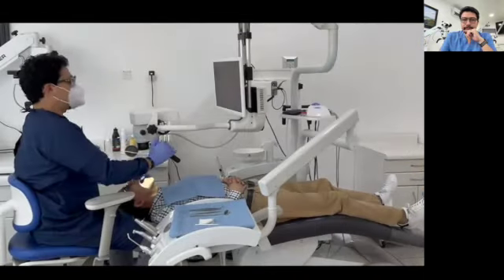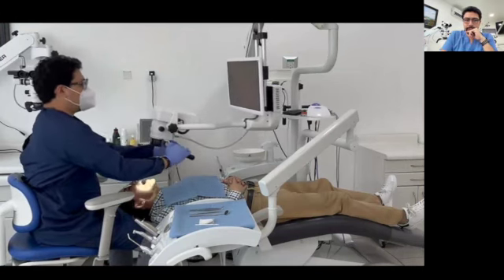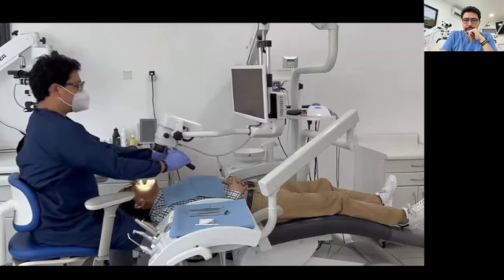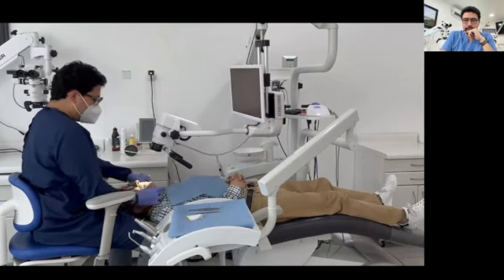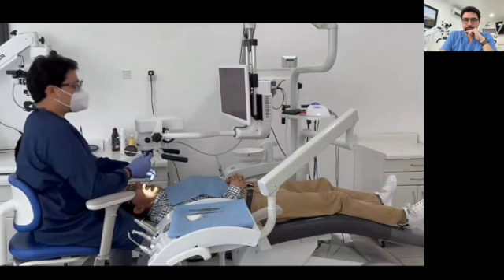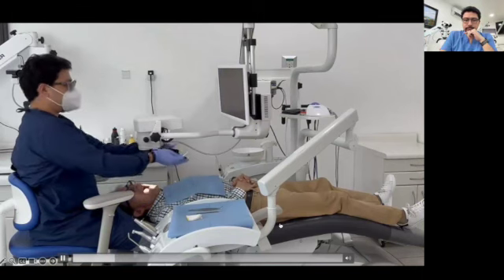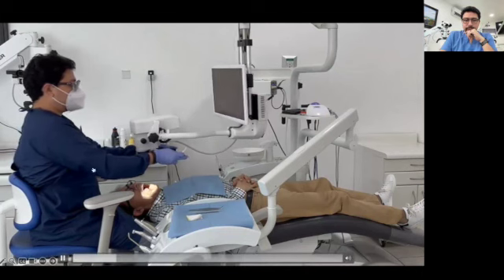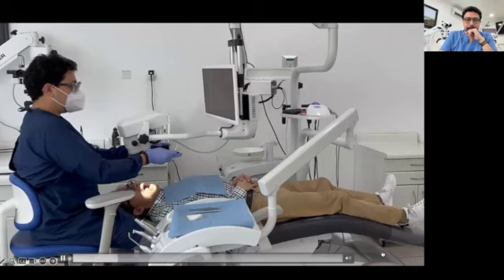It is important to have in mind that the clinician will have unlimited possibilities related to the angulation of the optical pod and the patient positioning. During the next minutes, I will show you some examples on how to angulate the optical pod and how to position the patient for working in some areas of the oral cavity, but these are just examples. The final setup will rely on the procedure to be performed.